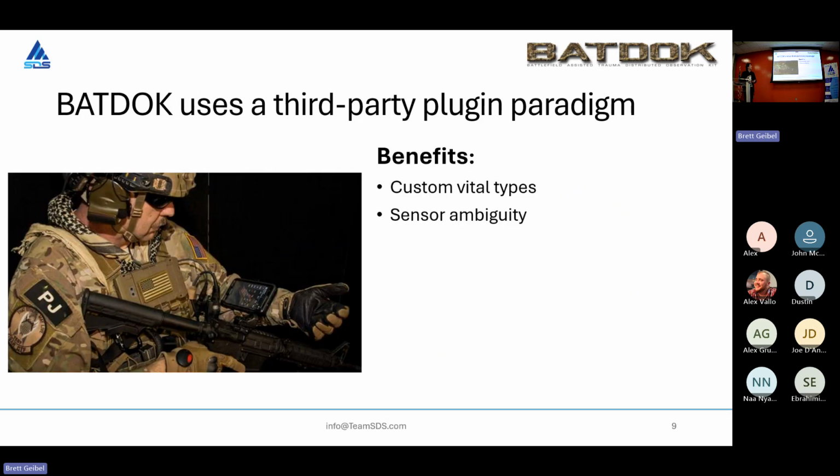Another benefit is that this paradigm also allows custom vital types. So if your sensor, for example, is taking a unique approach, or maybe is a forerunner in medical technology, reading some sort of vital that's not very common, BATDOK actually has capabilities to show that data in a digital way to the medical professionals and people taking care of our military personnel on the battlefield.